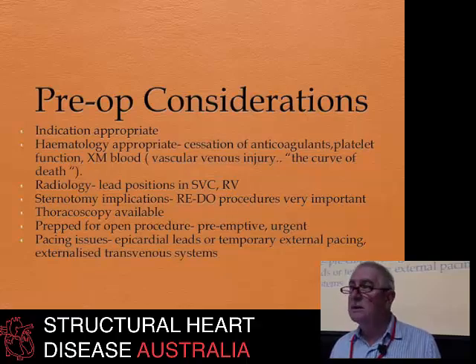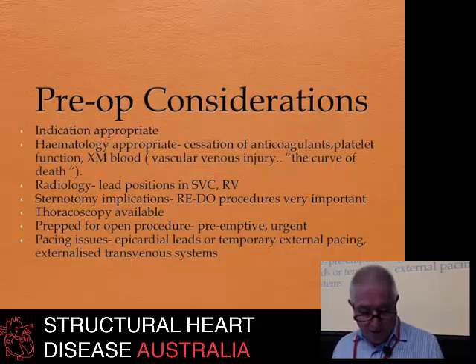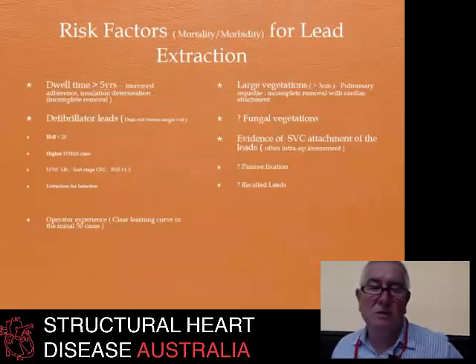And of course the final thing is you need to be aware of what the pacing issues are. A lot of these patients are pacemaker dependent. You take their leads out, they need to have something to keep them going, and generally speaking I would prefer to put on an epicardial lead as opposed to a temporary pacemaker, because there's a significant chance you'll dislodge the temporary device during the extraction.